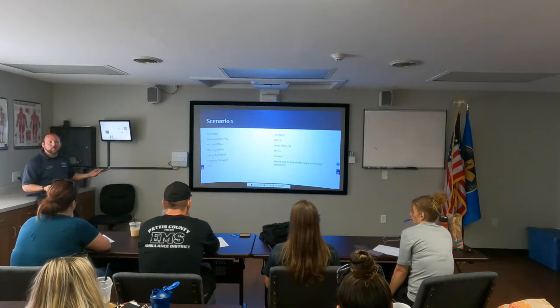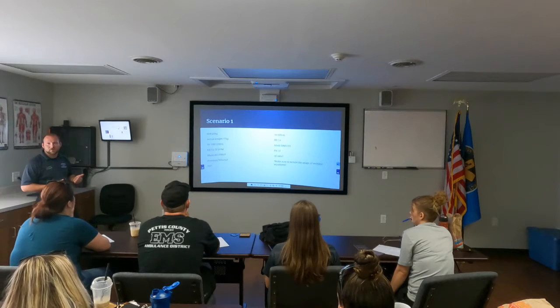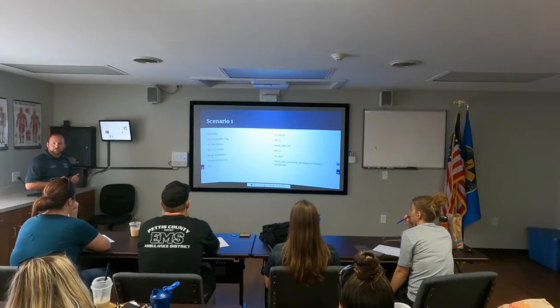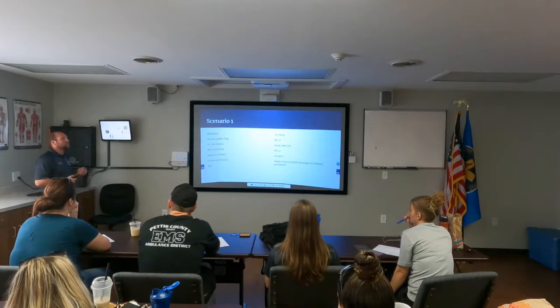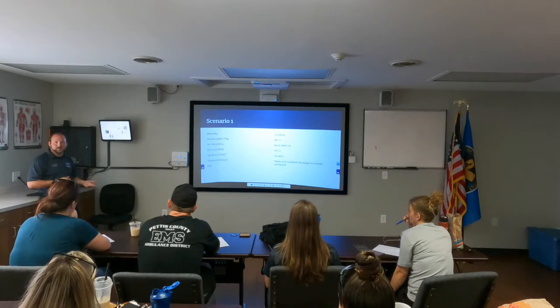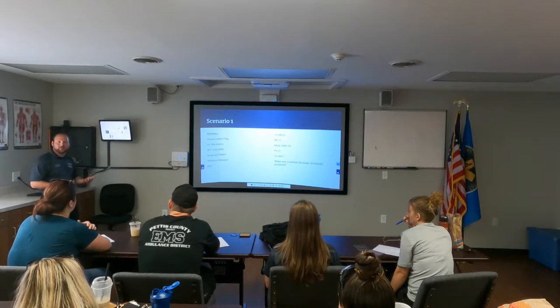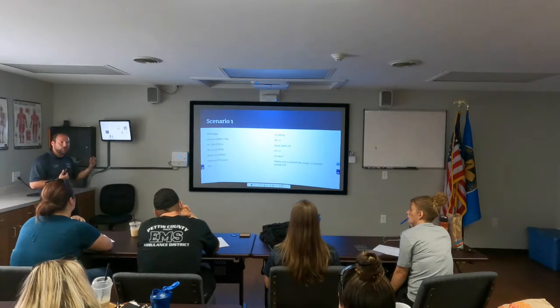Are you going to use AC mode, or are you going to use SIMV for her upon your initial intubation if you choose to do it? SIMV. Okay. Why SIMV as compared to AC? Because she's still kind of actively breathing. She has a respiratory rate right now. Okay. Yeah, that's a good point. The thing is, though, if we introduce a paralytic now, are we still going to be using SIMV, or are we going to be using AC then? Okay. You can still use SIMV even with the paralytic. Just keep that in mind that when it wears off, the patient will start having a respiratory effort as long as they are not in full arrest, and that hopefully their diaphragm is still working so that they can have it.